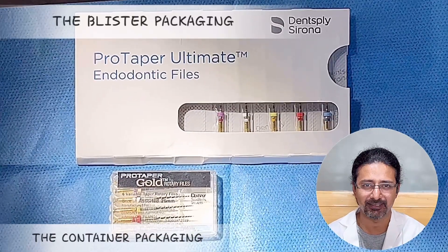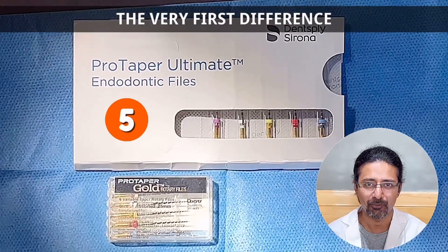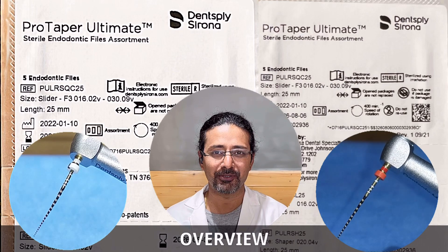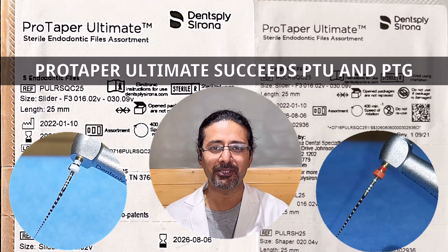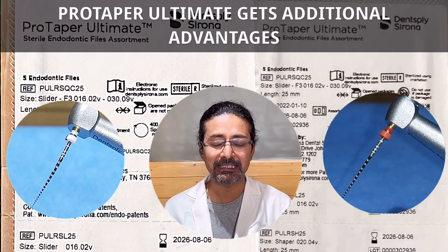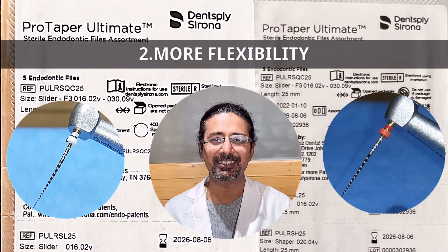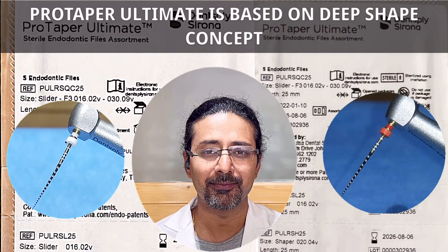Very impressive — the design language. The first one is Pro Taper Ultimate. We get a total of 5 files, whereas in Pro Taper Gold we get a total of 6 files. Pro Taper Ultimate Series is a successor to Pro Taper Universal and Pro Taper Gold. Keeping the original philosophy and techniques, Pro Taper Ultimate gets a few additional advantages: namely, resistance to cyclic fatigue, more flexibility, and of course simplicity.